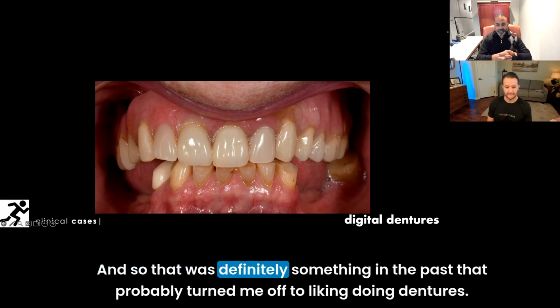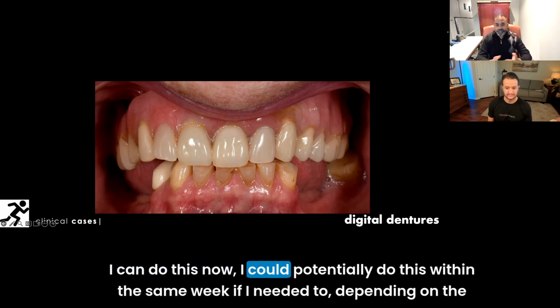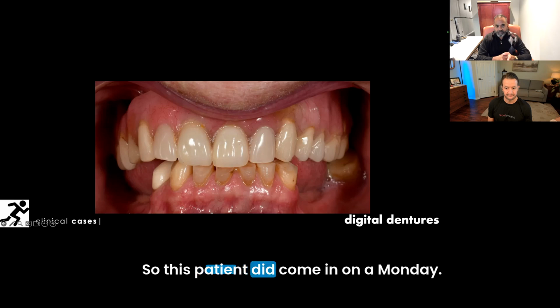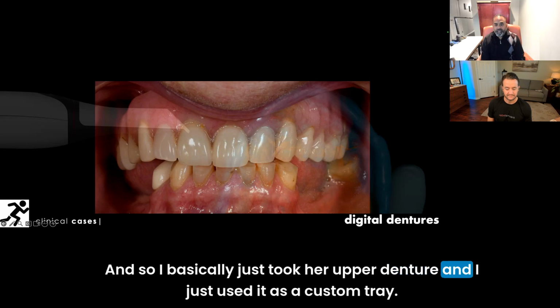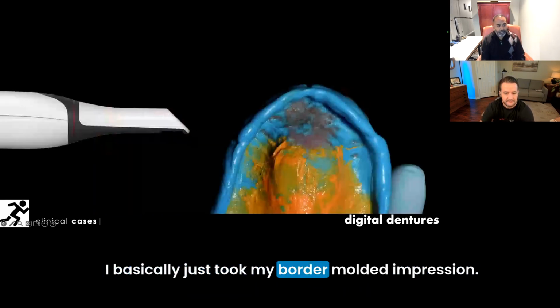And so that was definitely something in the past that probably turned me off to liking doing dentures. I can do this now. I could potentially do this within the same week if I needed to, depending on the relationships with my labs and the time that I have. So this patient did come in on a Monday, and I basically just took her upper denture and used it as a custom tray. I basically just took my border molded impression.